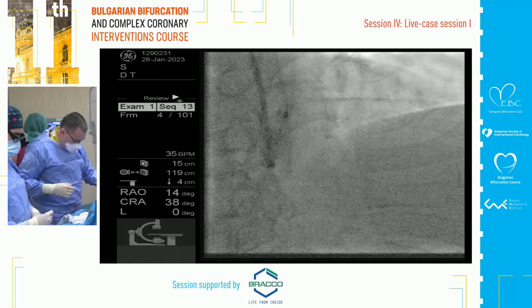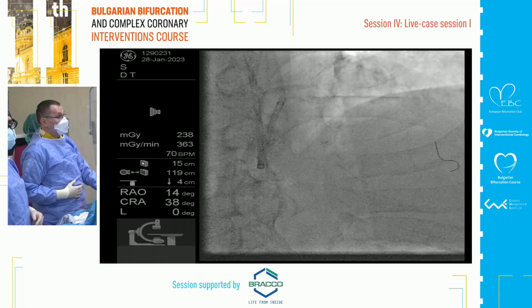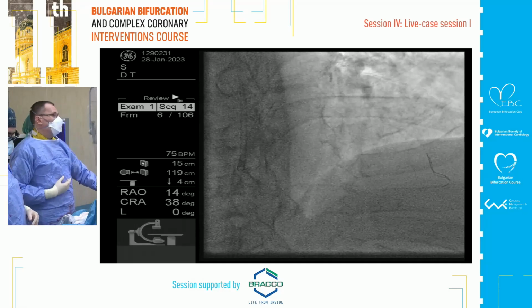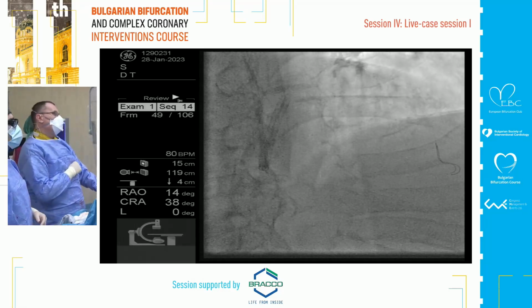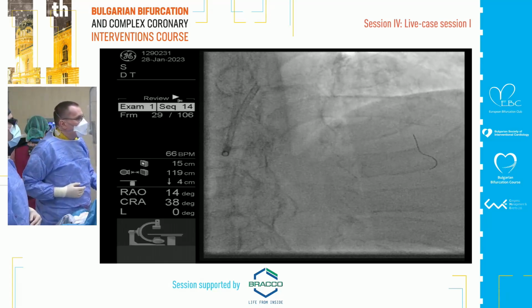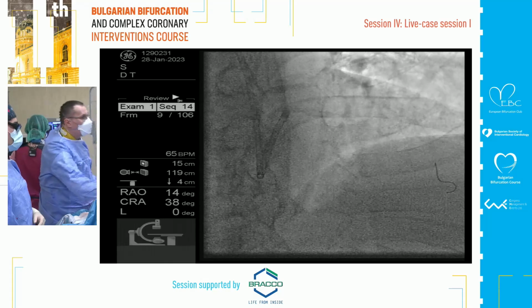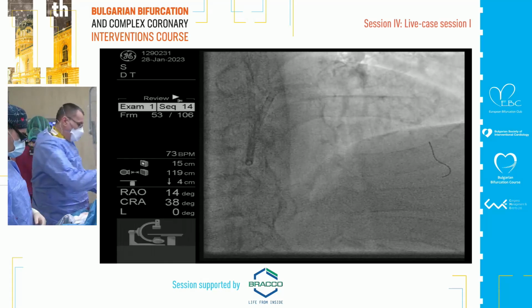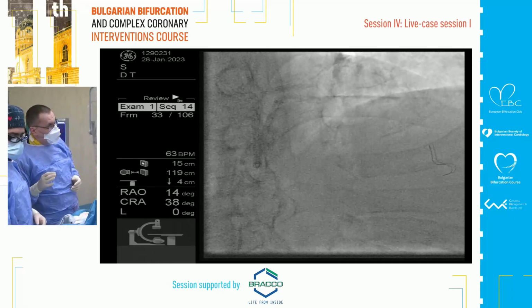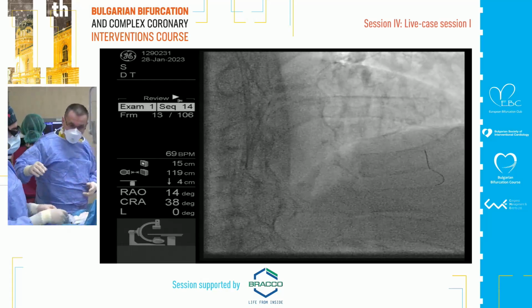Now we will do a control angio with Dr. Nenov, just to see the result after the rotablation. I think that we have even on angiography a visible crack of the lesion, so I will leave the rotawire in place and place a secondary wire, run through, and we'll try to do IVUS again, and I will ask Dr. Maihara to assist me in the interpretation.